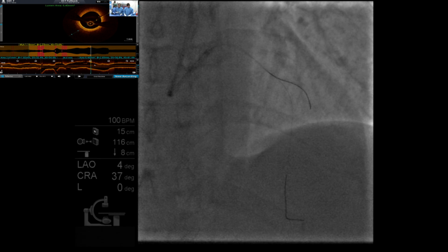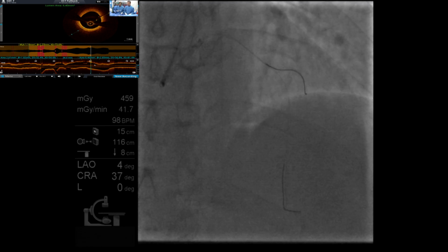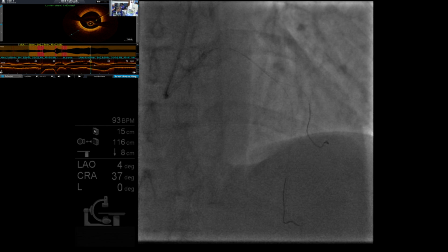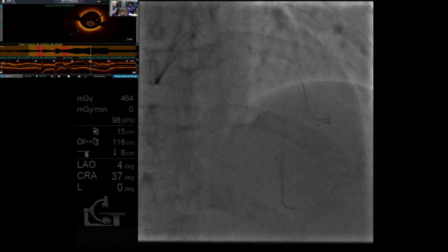And sometimes when I have a larger size stent, I don't even go to nominal pressure. Maybe I go to 6, then the second time I go to 8, very, very gently, and then I slightly pull back and then go to the nominal pressure. That's right.